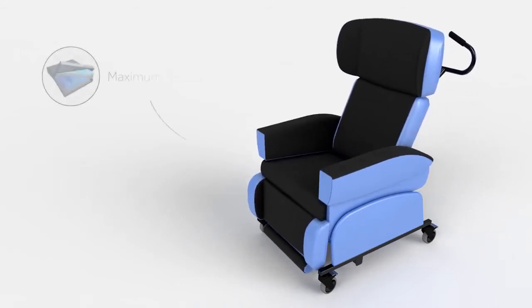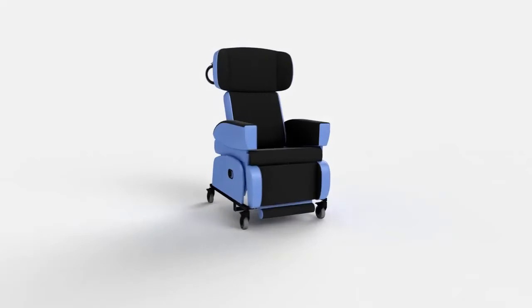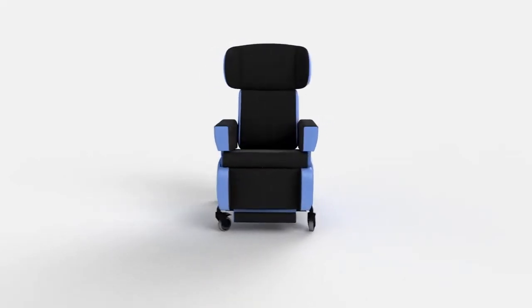The seat cushion uses our patented water cell technology and vapour permeable upholstery, which work together to provide continuous pressure relief.